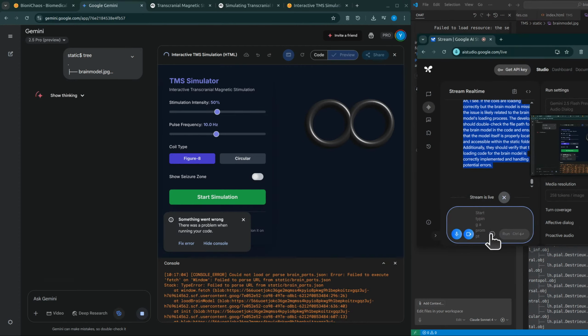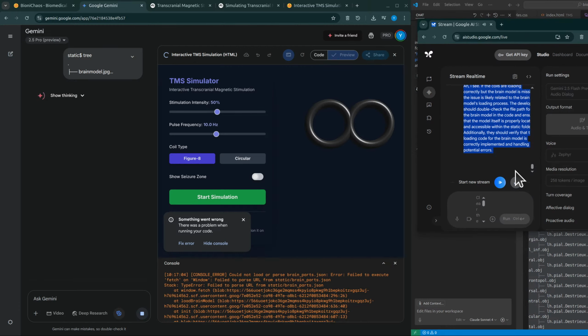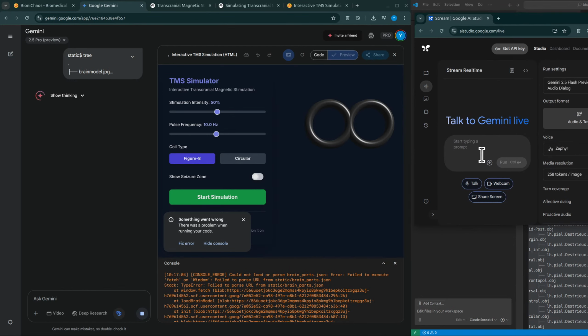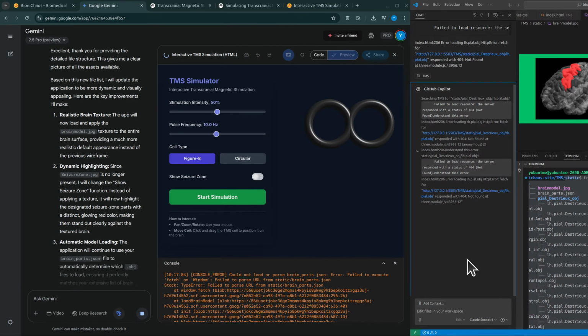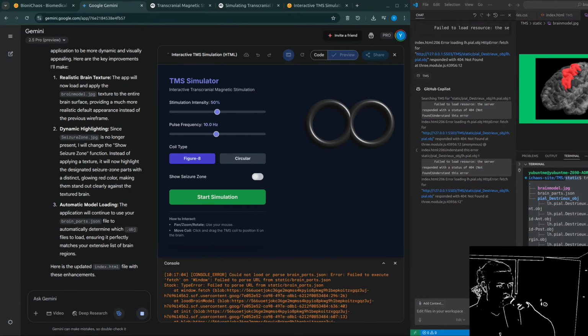Precisely. Are there specific software tools that researchers typically use for this whole anatomy to mesh process? Yes, definitely. The sources highlight SimNIBS quite a bit. SimNIBS? Yeah, it's popular, it's open source, and it's designed to automate a lot of this, taking the MRI data, handling segmentation, handling meshing. It's considered pretty accessible.